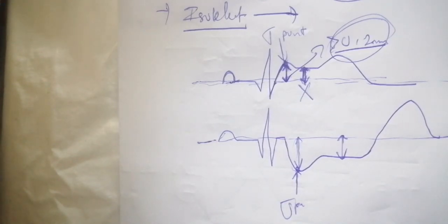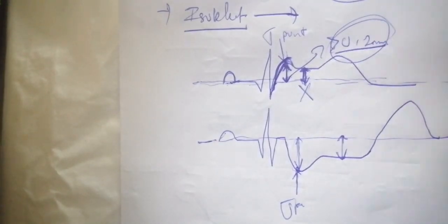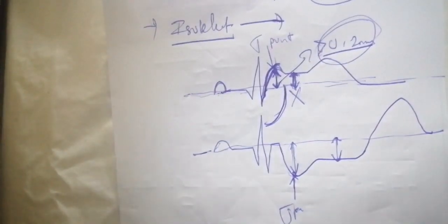Now we have to know that ST segment elevation and ST segment depression are different pathologies that you have to visualize. Generally, ST segment elevation in myocardial infarction is going to be localized on two contiguous leads that have the same locations. Is it clear? And it also has a convex elevation. While in pericarditis, they are much more diffuse and they have a concave ST segment elevation. So those are the different elements that you have to know on the ST segment.